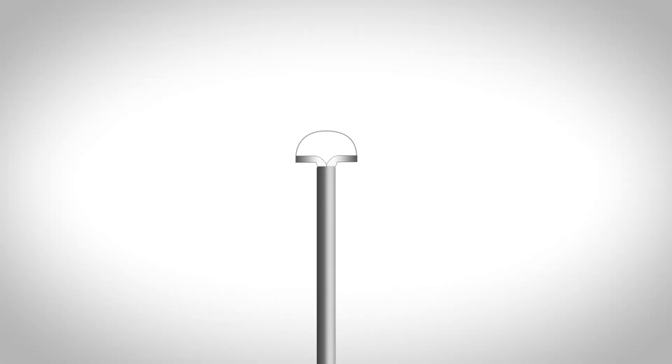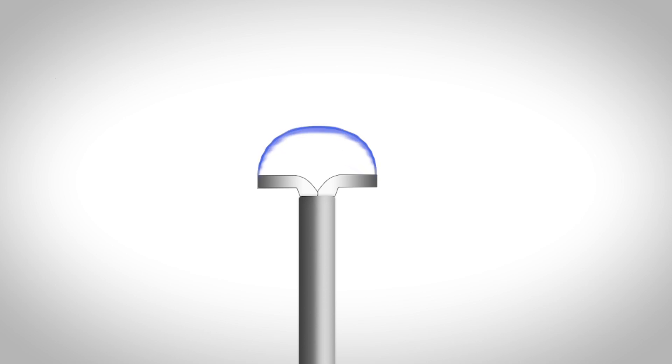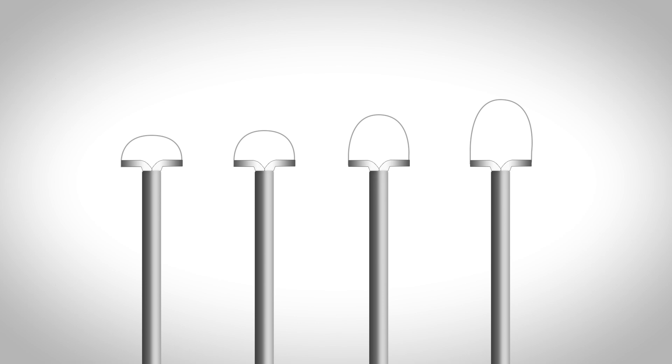The procedure itself is usually quite quick. I tell patients it's kind of an in and over and out, and that's the whole specimen. The loop is literally a small wire loop through which electricity goes, allowing cutting and prevention of bleeding at the same time. We have multiple different sizes of that loop so we can tailor it to the size and shape of the cervix.